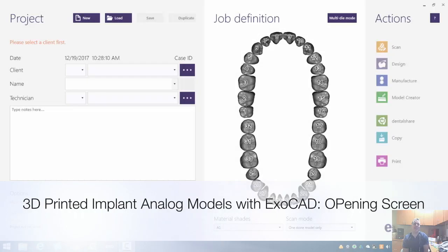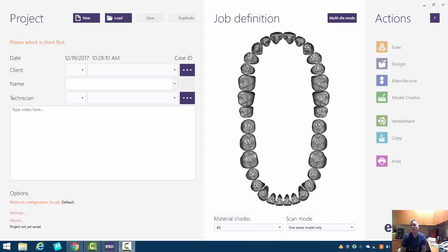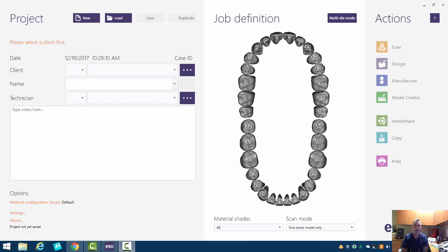Hello everyone, this is Dr. August de Oliveira from Digital Enamel, and today I wanted to cover using the new build in ExoCAD, how to do an implant analog model with a removable and reusable analog.